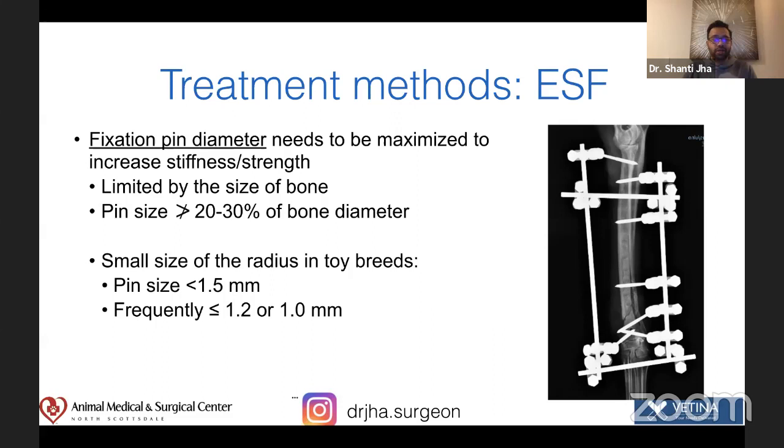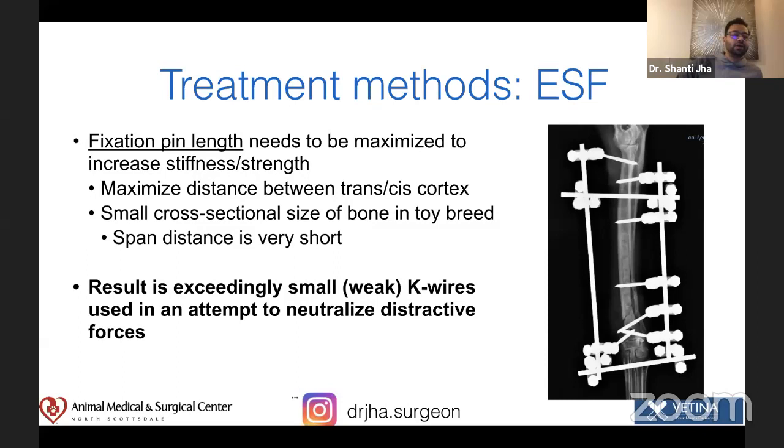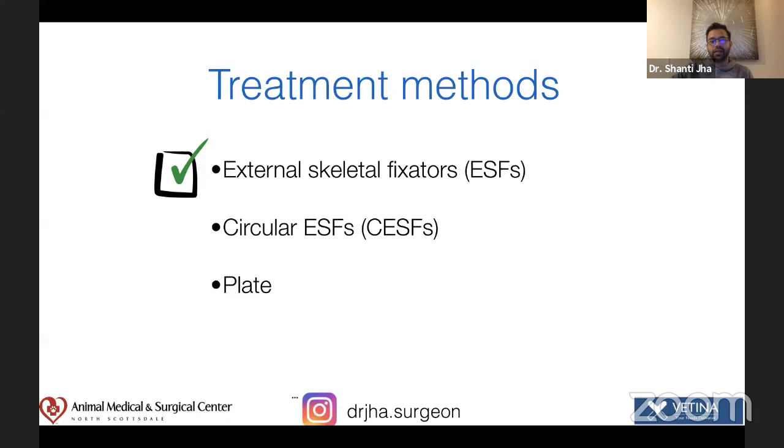But again, I'm limited by the size of the bone. So if pin size is greater than 20 to 30% of bone diameter, that is a problem, right? And then with the small size of the radius in toy breeds, you're using teeny pins and that doesn't give you good stability, but still it's doable. So this whole construct, again, results in exceedingly small pins or K-wires, which in my experience hasn't helped me to properly fix or repair these fractures. So I stay away from that. Well, let's talk about circular external fixator a little bit.